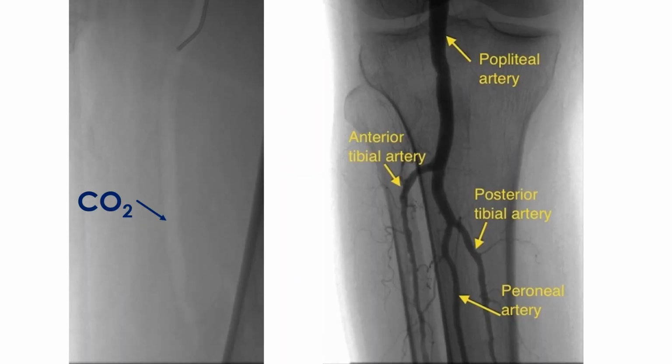Usual angiograms appear dark while carbon dioxide angiogram looks grey because of the lower density of carbon dioxide compared to tissue. Conventional angiogram is shown beside the CO2 angiogram for comparison of opacification. Please note that the angiograms are not in the same projection. The better contrast with conventional angiogram is obvious. While conventional angiograms look like positive images, carbon dioxide angiograms look like negative images.